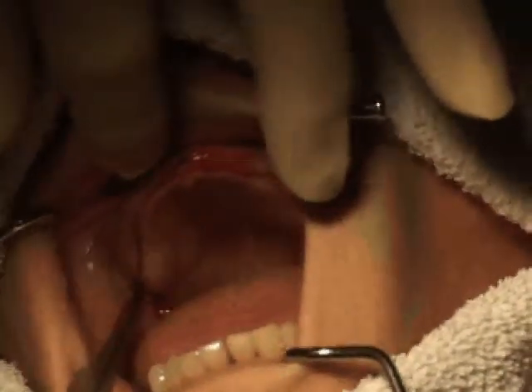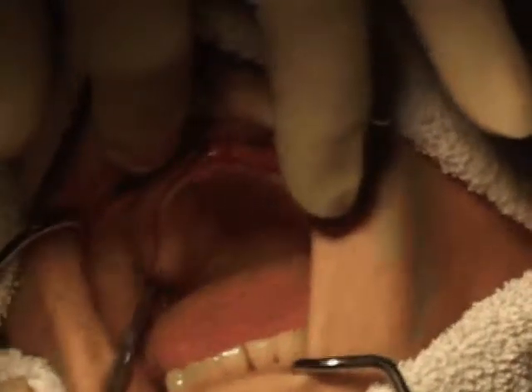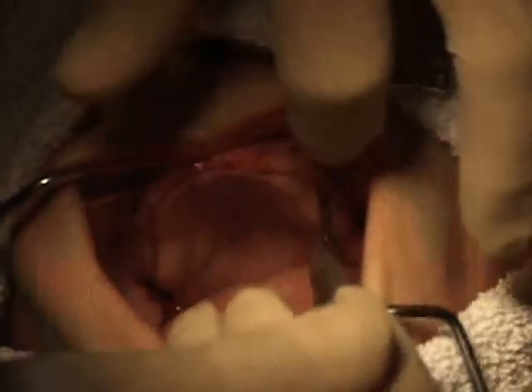The posterior right relieving incision is in the posterior lateral part of the tuberosity. The left releasing incision is done again contralaterally along the posterior lateral part of the tuberosity.